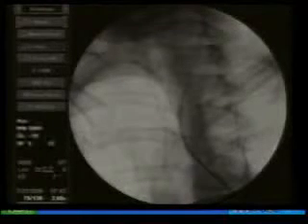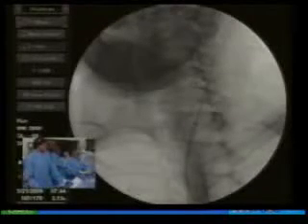So, what sheath is it, Ty? This is for the neuroprotection system. So, can we see the next picture, please? So it's a 10 French sheath? It's 9 French, 9.5. And we have the 10 French long sheath in the groin. So Steve got this up into the common, and then he just basically held in the wire and the introducer telescope the sheath into the common carotid, sort of at the level where we're going to be working.